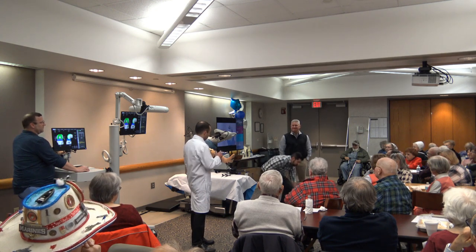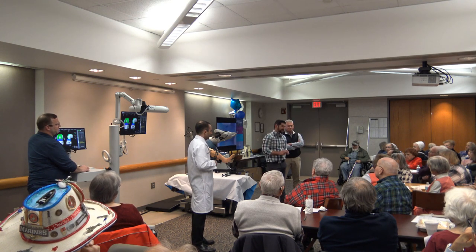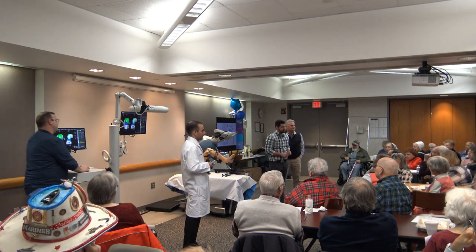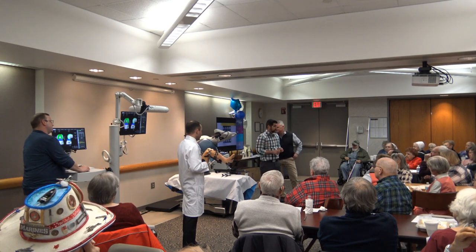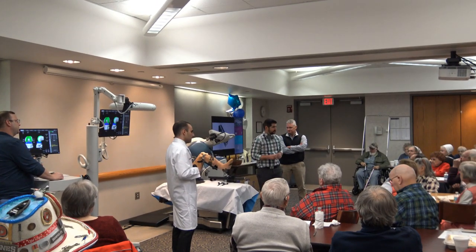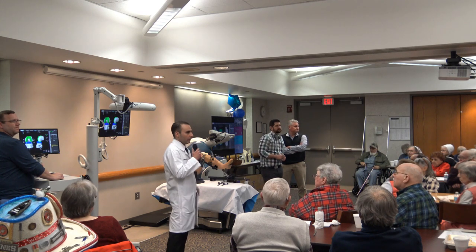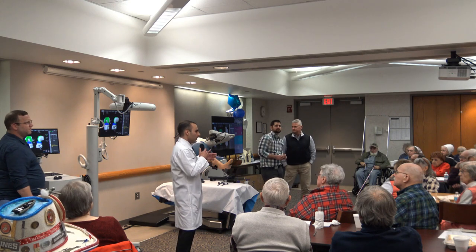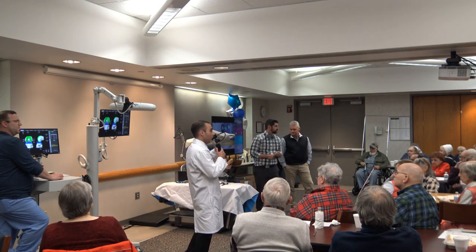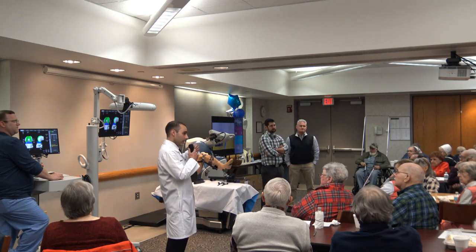Regarding tourniquets: it is surgeon preference whether to use one or not. I still use a tourniquet because it allows me to see the knee very well during surgery, minimizes blood loss, and reduces the risk of transfusion. Typically the tourniquet is up for 45 minutes. One thing this technology has allowed me to do is use less cement — we can press-fit more — and I've seen patients be more comfortable with press-fit, possibly related to how hot cement gets and how that affects the bone. Also, because we're not using intramedullary rods down the canal to place our jigs, there could be less bleeding from inside the canal.